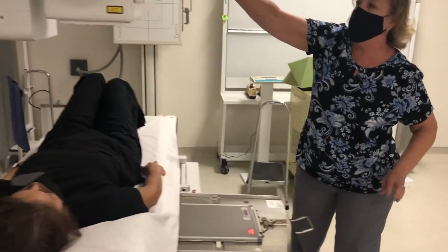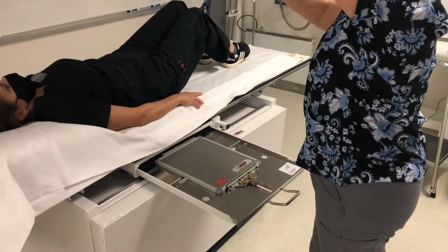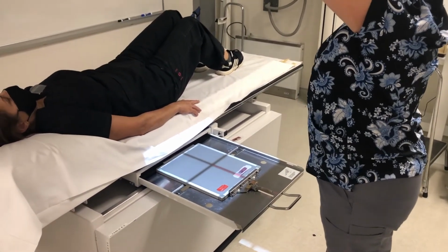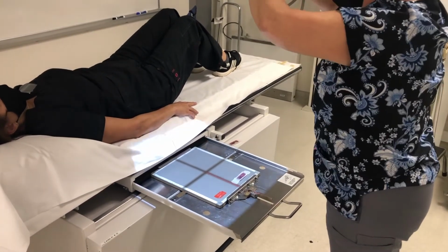Generally collimate down to about 10 by 12 for this. Sometimes a little smaller, but you don't have to. 10 by 12 is fine.